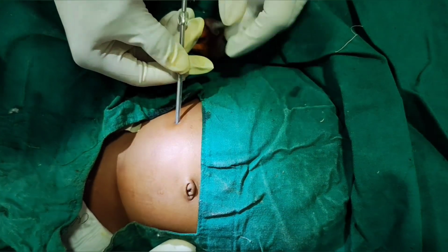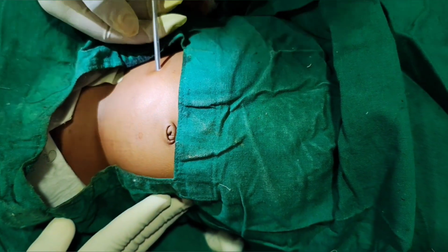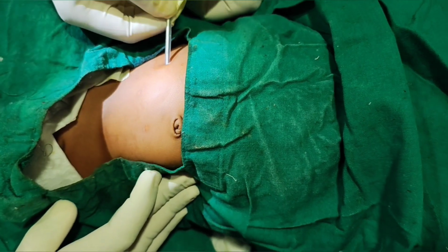Entry of this catheter tip into the peritoneum is evident by the sudden loss of resistance and also by the appearance of the PD fluid in the transparent catheter.